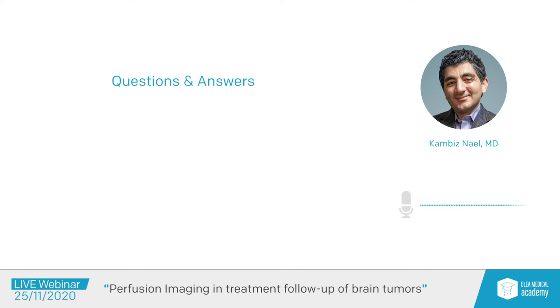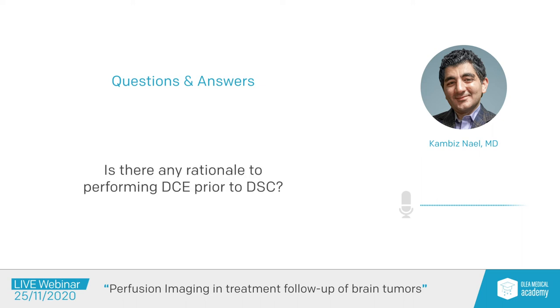Thank you very much. Another question: is there any rationale, I believe there is, but I'd like you to explain it, to performing DCE prior to DSC in terms of contrast agent and results? If you are going to do both, you have to do DCE first because it's a T1-based technique. If you have contrast on board, you can't really do DCE, because you need a non-contrast phase, then you give contrast, and then you look at the T1 change between the baseline and the effect of contrast injection. So DCE needs to be done first.